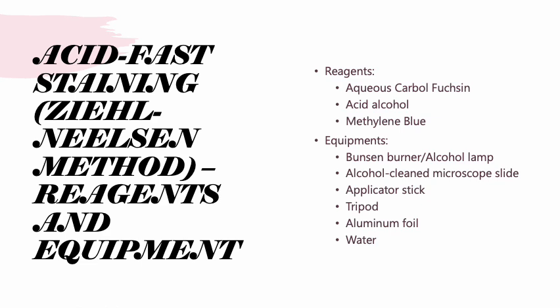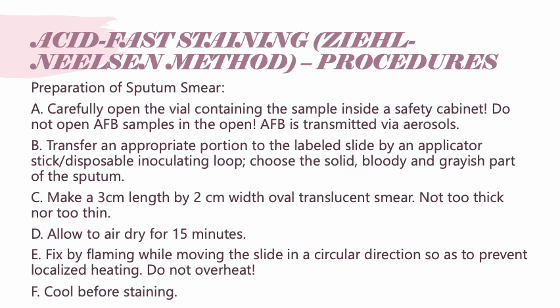Equipment needed: Bunsen burner or alcohol lamp, alcohol-cleaned microscope slide, applicator stick, tripod, aluminum foil, and water. Now, the step-by-step process of the preparation of a sputum smear is the following.